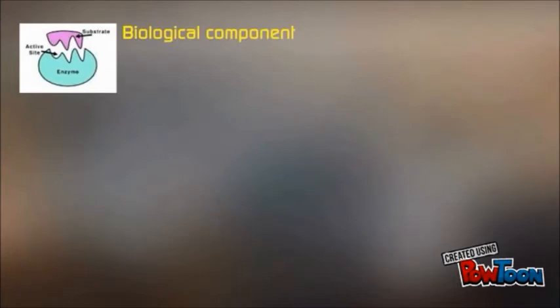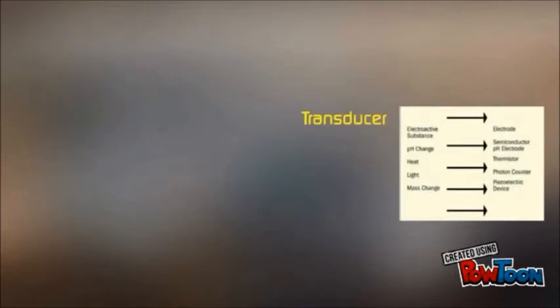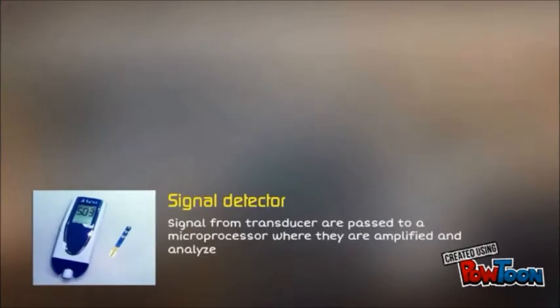The biological component is used to interact specifically with a target compound, such as microorganism, tissue, cell, organelle, nucleic acid, enzyme, and antibody. The transducer acts as an interface, measuring the physical change that occurs with the reaction at the bioreceptor, then transforming that energy into measurable electrical output. Then, the signal from the transducer is passed to a microprocessor where it is amplified and analyzed. The data is then converted and displayed on a monitor.